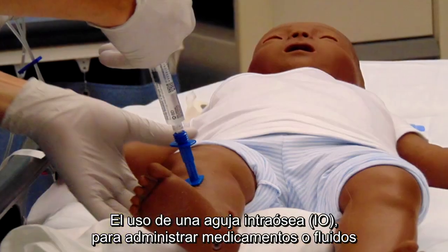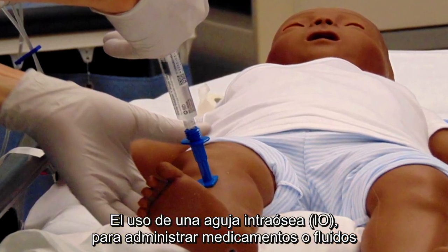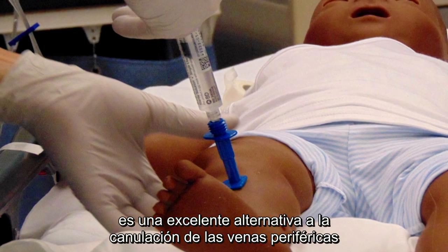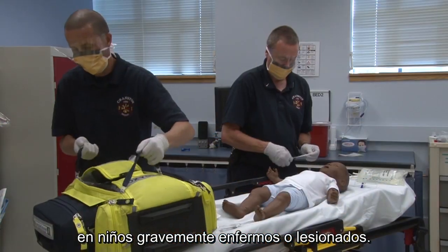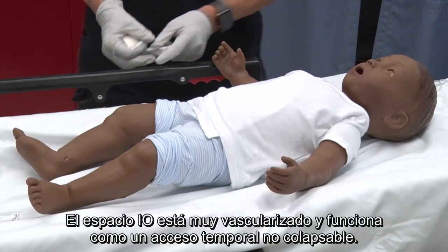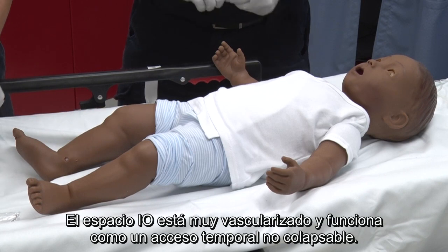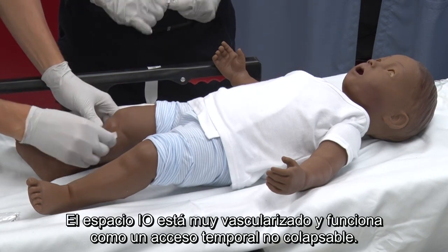Using an intraosseous or IO needle to give drugs or fluids is an excellent alternative to cannulating peripheral veins in critically ill or injured children. The IO space is highly vascular and functions as a temporary, non-collapsible access.